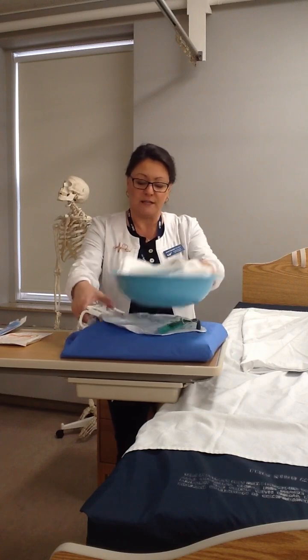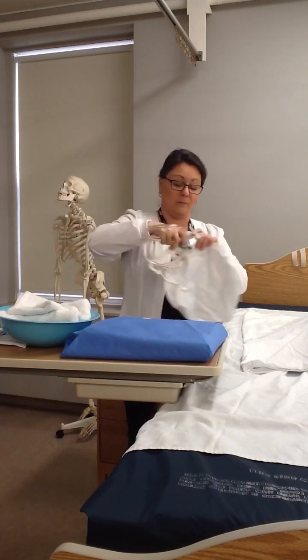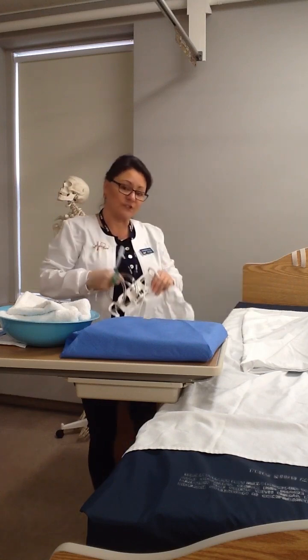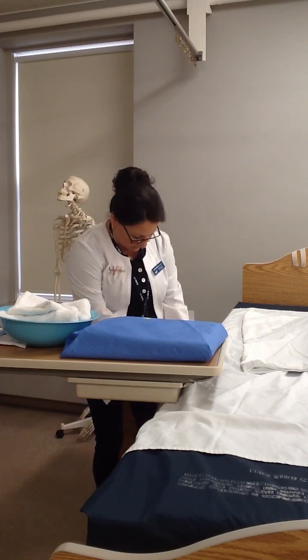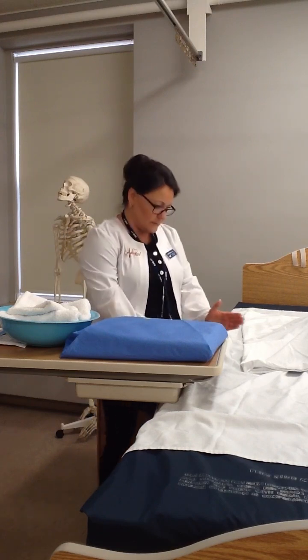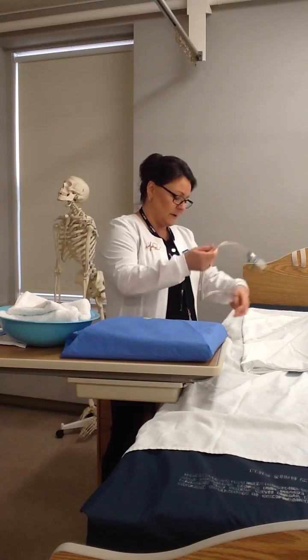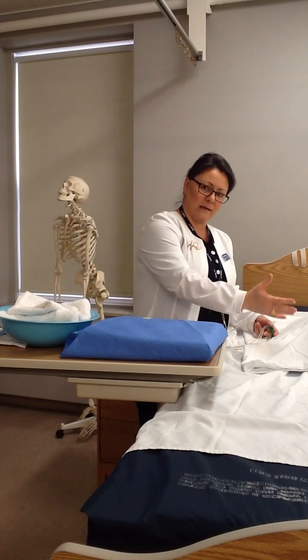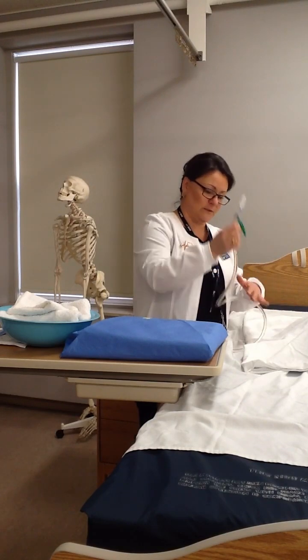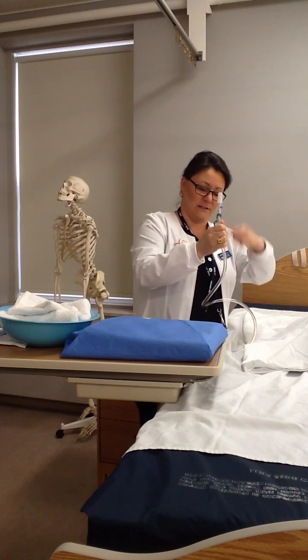The next thing I'm going to do is attach the urine collection bag. This has to be attached to the bed frame, not the bed rail. So I'm just going to find a hole, and I found a hole right here on the bed frame, pretty much in the same area, directly across from the patient's hip area. And then the tubing on top is just going to coil in front of me, and that's going to be very convenient for me to grab when I'm done inserting the catheter and I need to attach this tubing to the catheter for the urine to come from the catheter into this tubing.